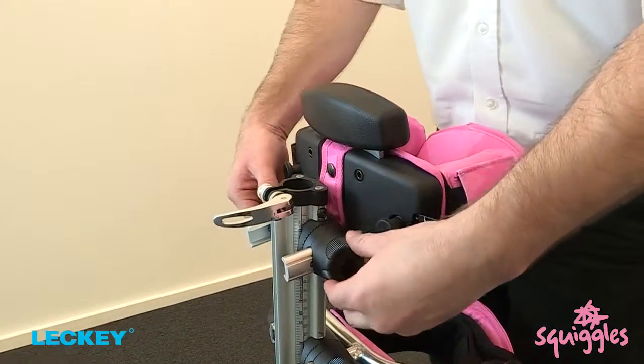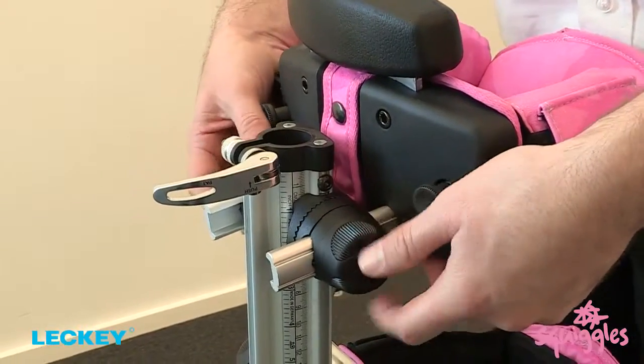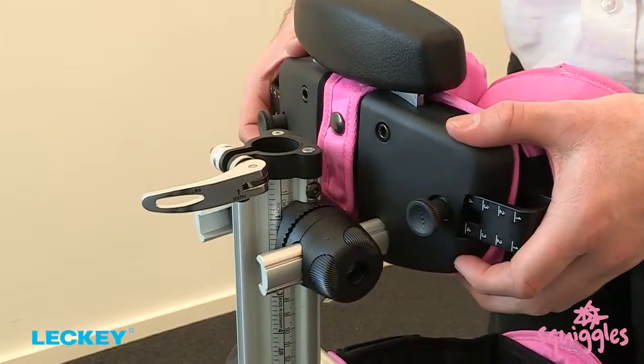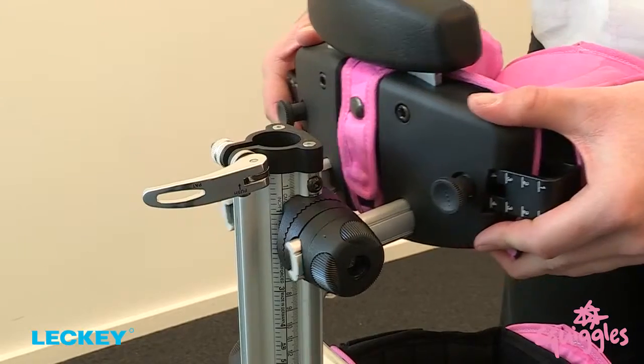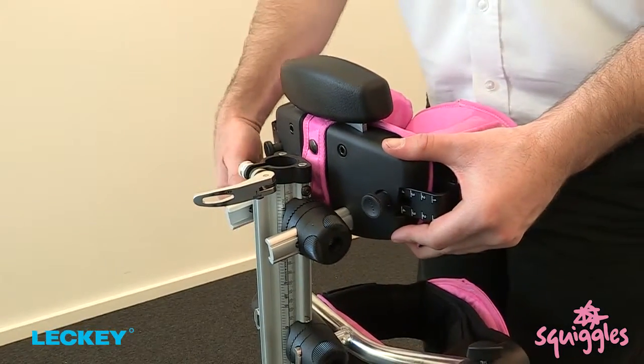The chest section on the Squiggle Stander cannot be height adjusted, but can be depth and angle adjusted by rotating the coffee jar lids in an anti-clockwise direction.